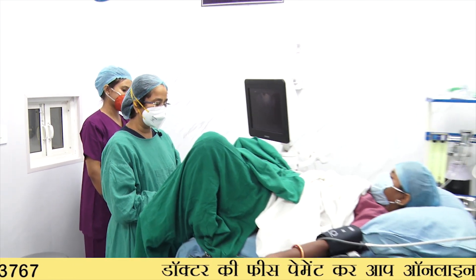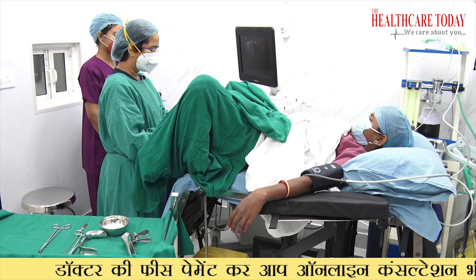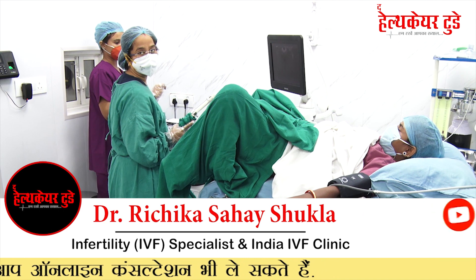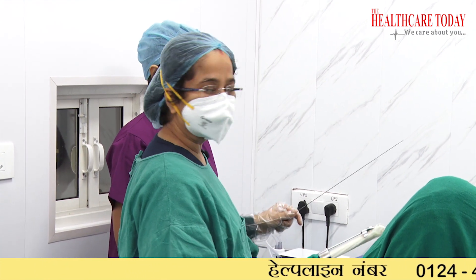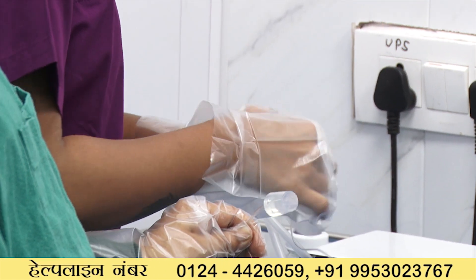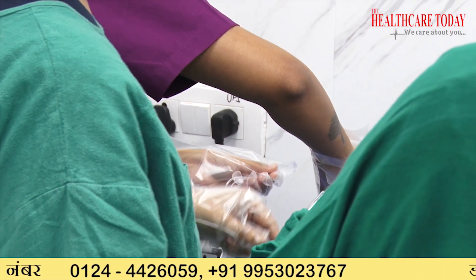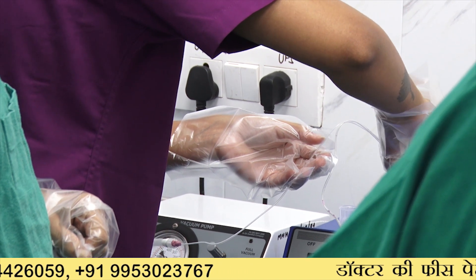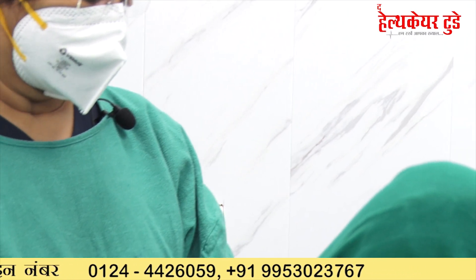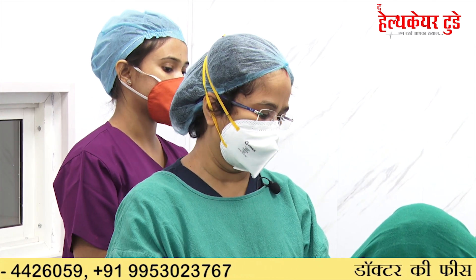We clean the vagina and then start the fluid aspiration. We put the probe inside the vagina and take the needle — a junior doctor is always present to assist. This is the ovum pickup needle; two types come — single lumen and double lumen. We preferably use a single lumen needle. This needle has two ends: one end is connected to the suction machine, and the other end goes into the test tubes in which we collect the follicular fluid. The probe is placed inside the vagina and the needle is inserted into the hole of the biopsy guide.